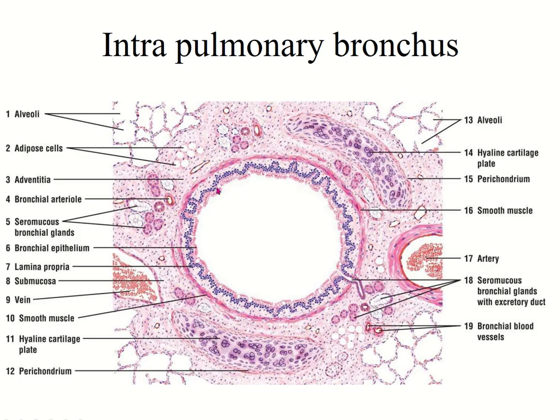This is the goblet cell. Goblet cell looks like a white colored dot because it contains thick mucus secretion which washes out during histological slide preparation. So it looks white.